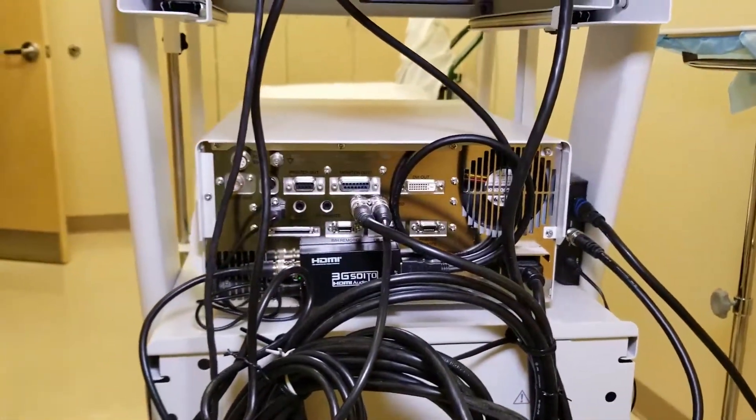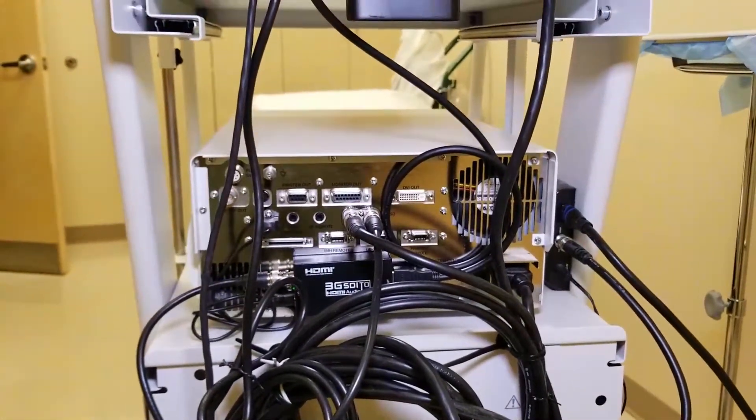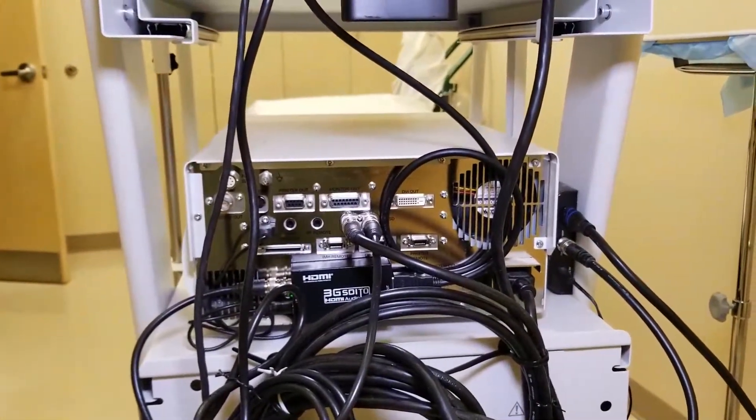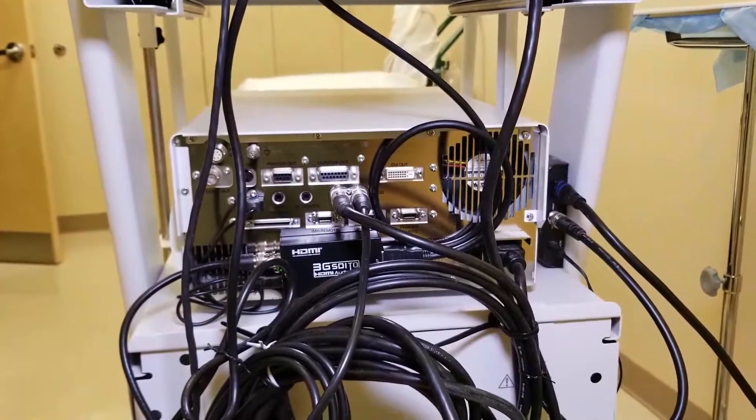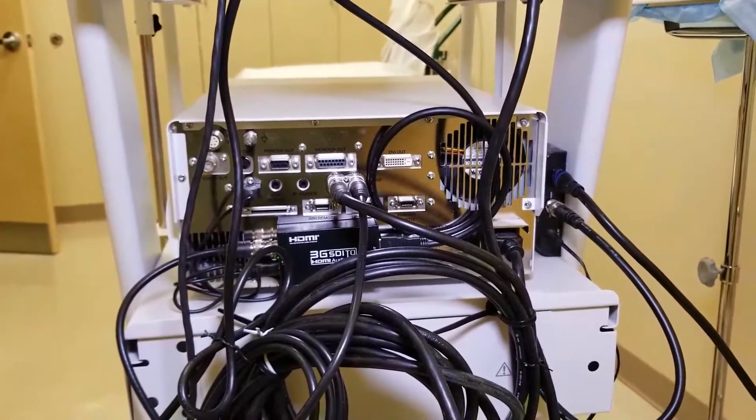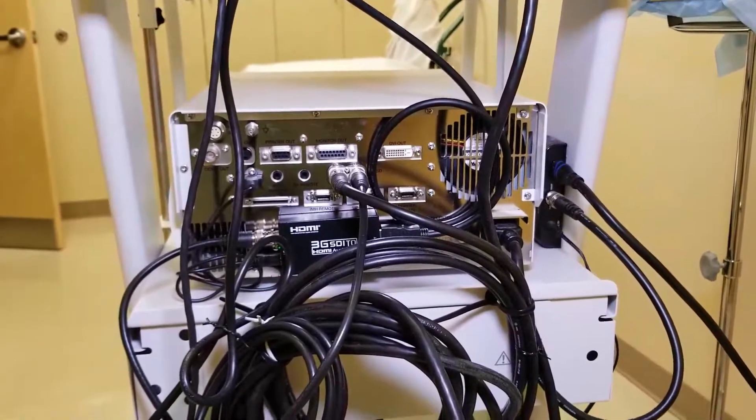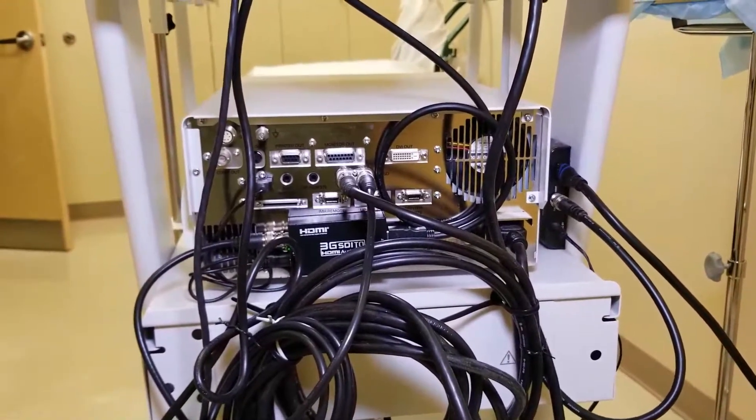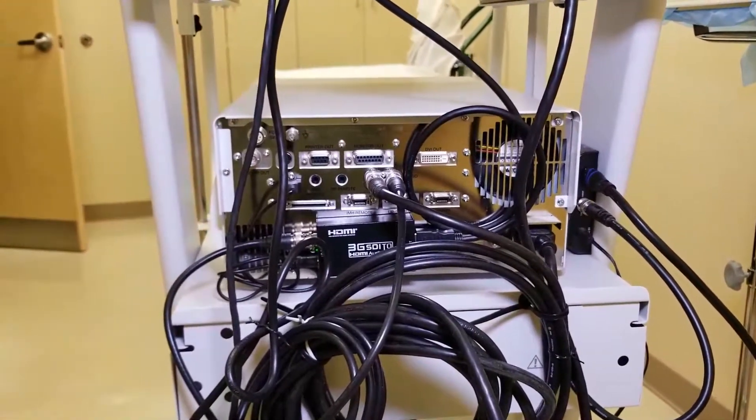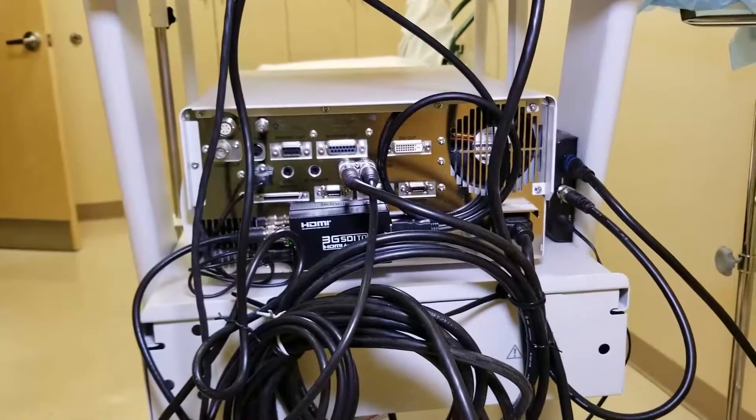So it's a very simple, inexpensive setup for you to have multiple monitors coming out of your Olympus video setup.